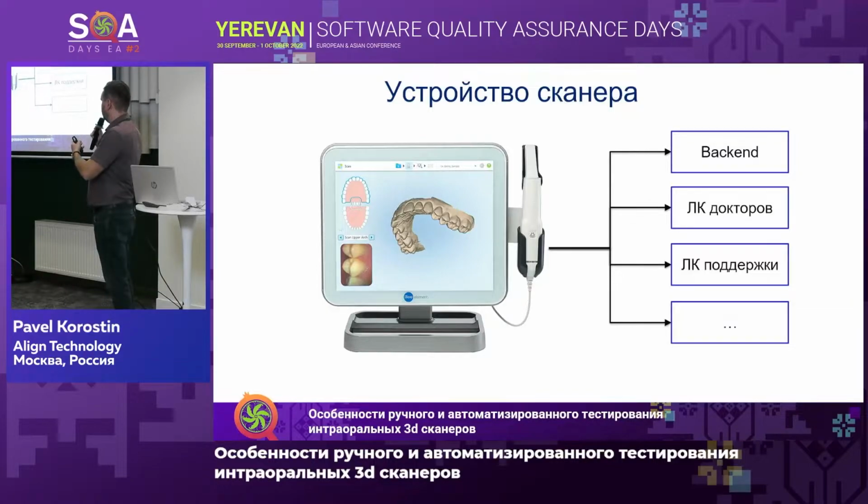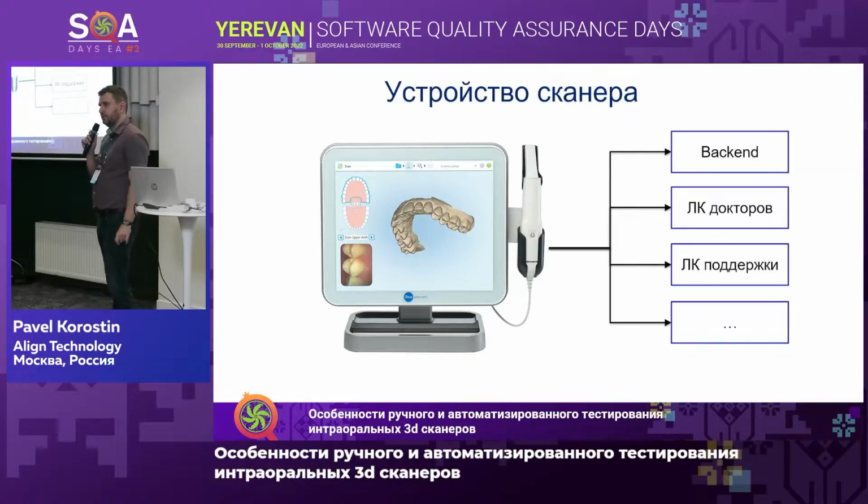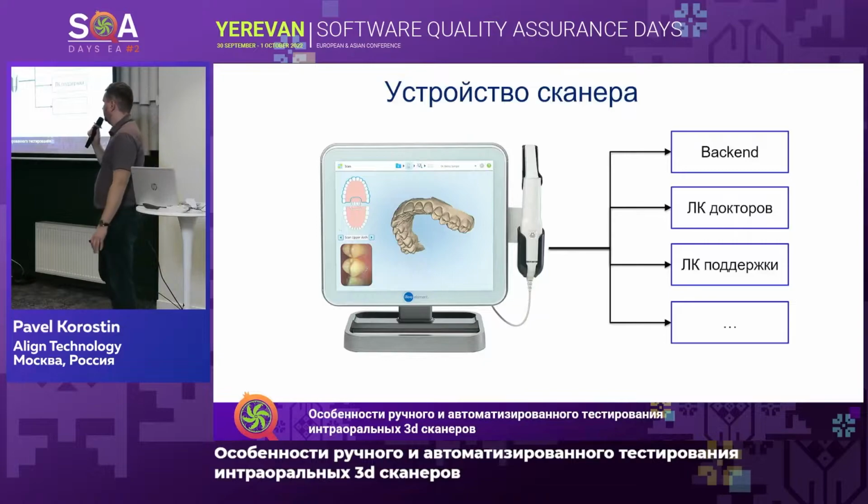Of course, it's not the end of the story. The scanner has quite a robust backend, all sorts of services used for the subsequent development of the model, cabinets and portals for doctors for their maintenance and support. But the scanner itself can build the model initially, autonomously, and as my group is testing mostly the scanners themselves, we, in principle, do not depend that much on the environment.